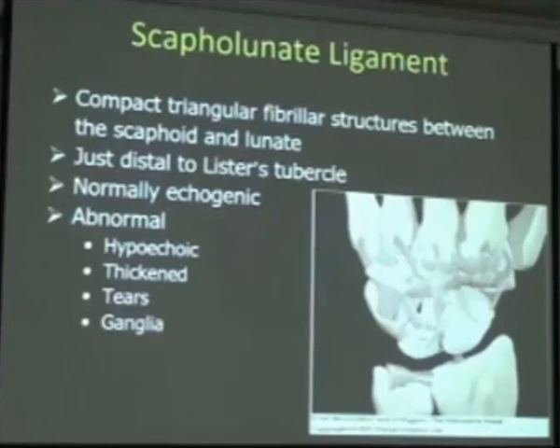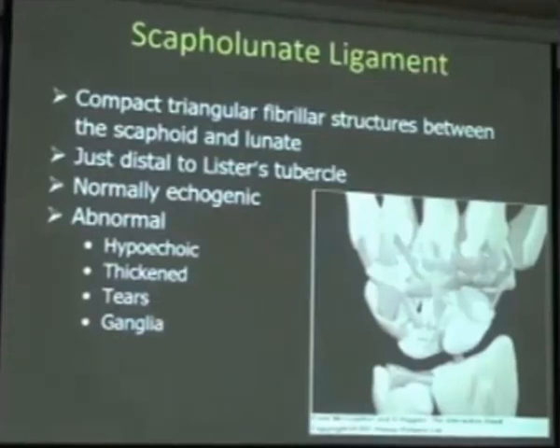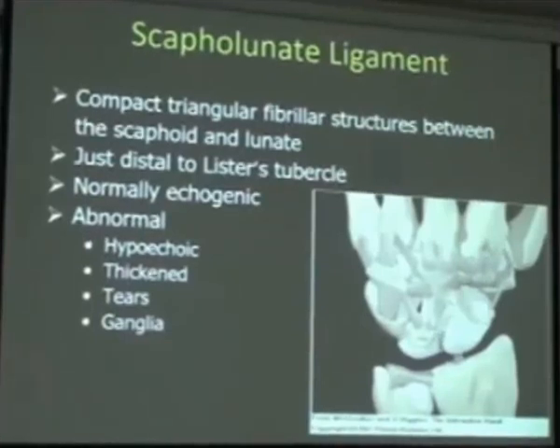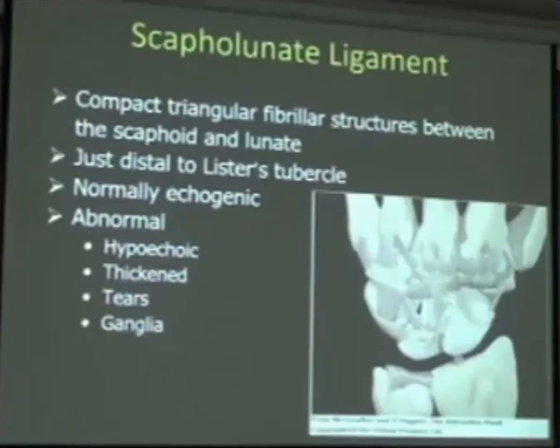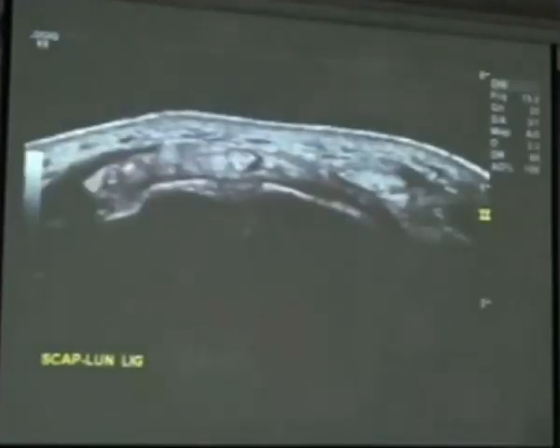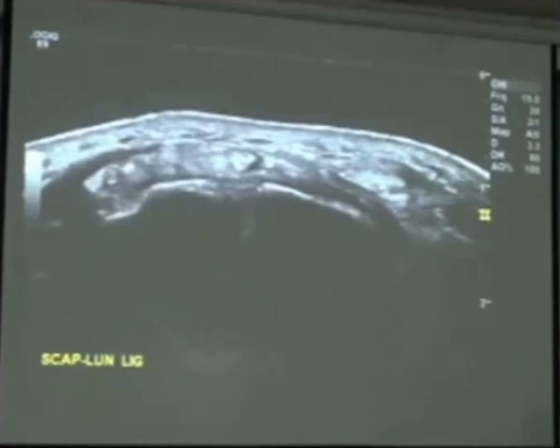Another important ligament to assess is the scapholunate ligament. It is located just distal to Lister's tubercle — just distal to that little bony bump. As we move distally, the first thing we come across is this little ligament. It's common to see hypoechoic thickening, tears, or ganglia coming out from that joint. You can see the ligament just going between the lunate and scaphoid.